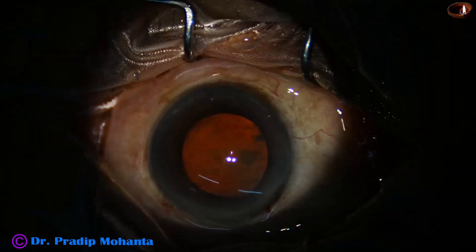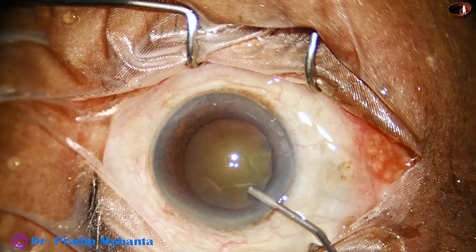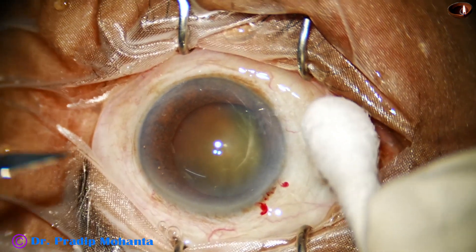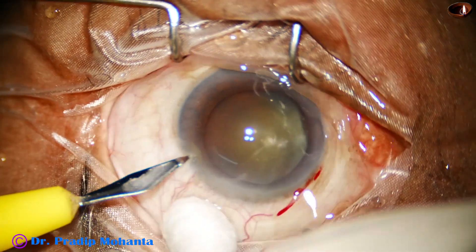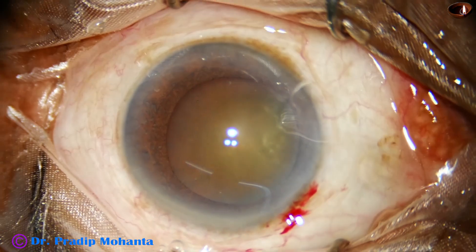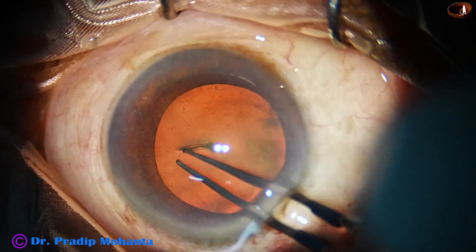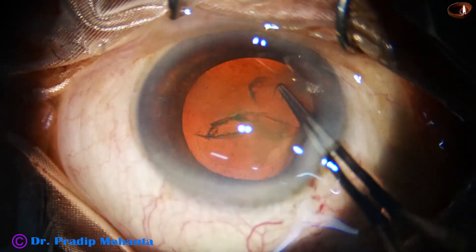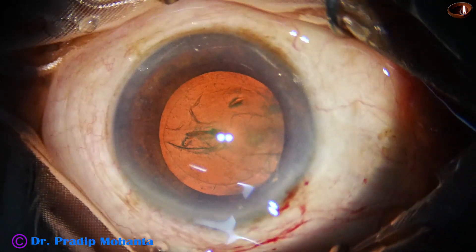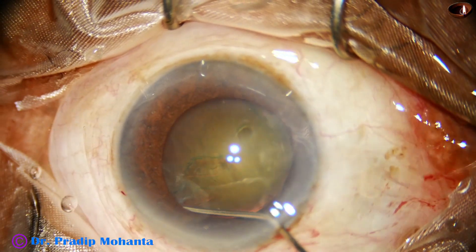The initial steps are done. The main incision has been done. The red glow is good, so we need not use a dye to stain the anterior capsule. The side port is done on the left side of the main wound, about 3 o'clock hours away. We use the stereo coaxial illumination to do the capsulorexis. The microscope is Lumera T from Zeiss, and Utrata forceps is being used. Size of the rexis is good, about 5.5 to 5.75 mm.